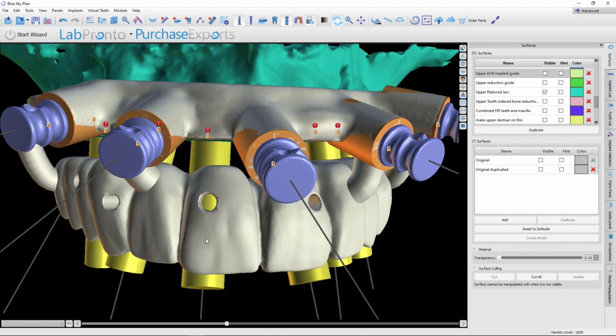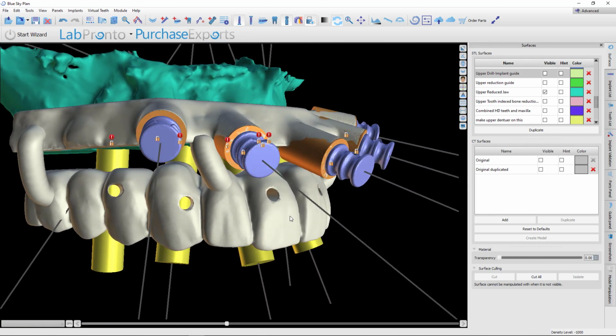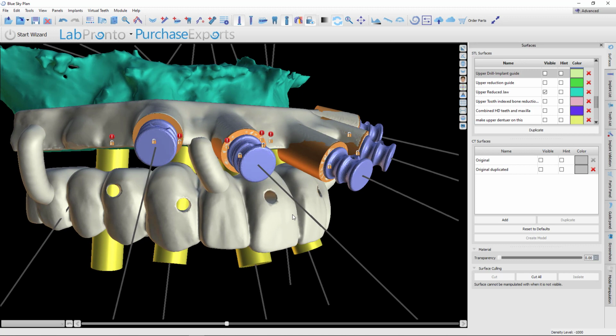Generally, I recommend delivering this and then suturing at the end after everything is delivered. So you're basically just snugging the tissue up to this final prosthetic. And if you do that, then just like a healing abutment, Danny Doming and I did an article called The Full Arch Healing Abutment with this same concept. Just like with a single tooth implant, your gingiva heals to that healing collar. The same thing applies full arch.